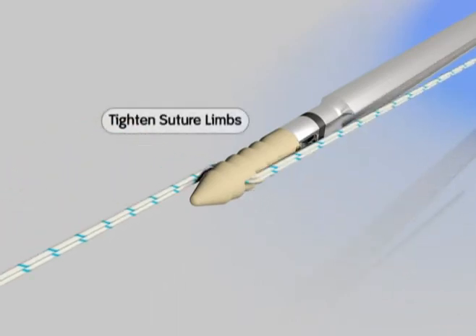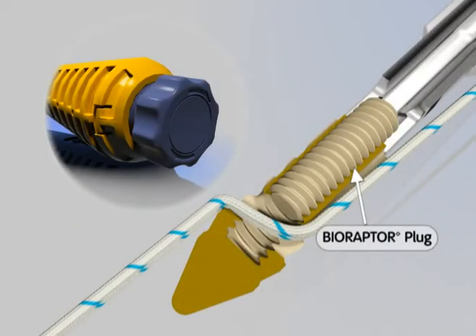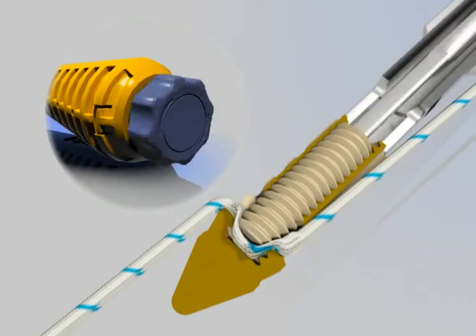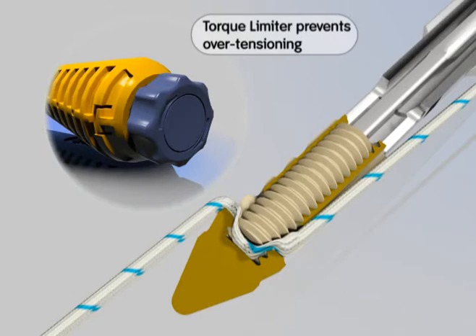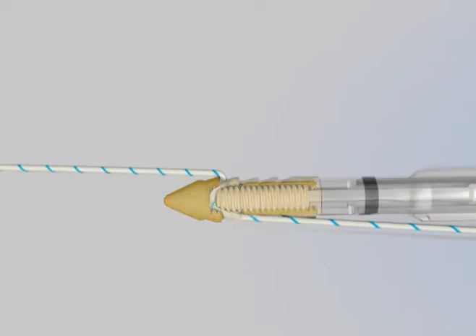The suture limbs are tightened and locked on the handle, and the torque limiter knob is turned 8 times to lock the suture into place. The torque limiter now measures the travel distance of the inner plug, ensuring it is properly advanced inside the anchor and locking the suture.